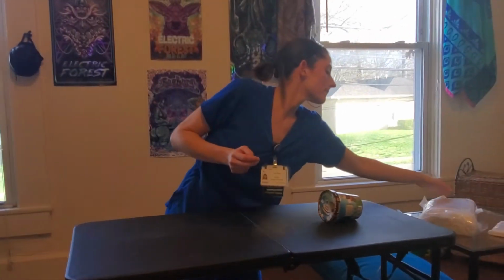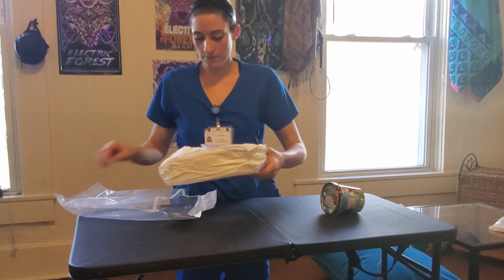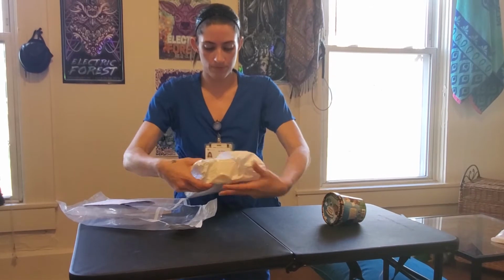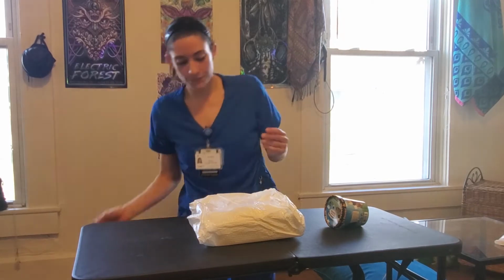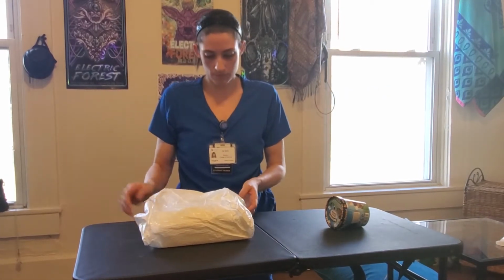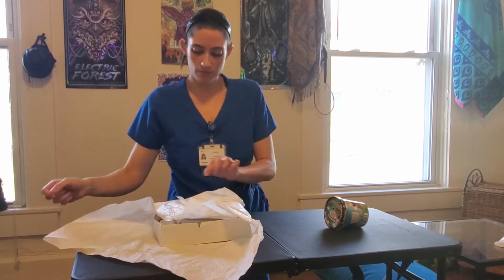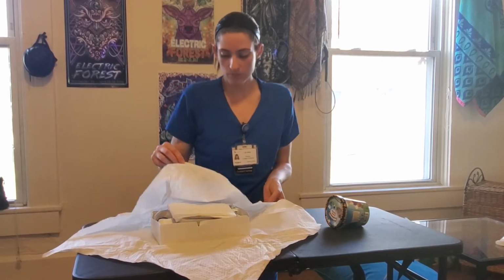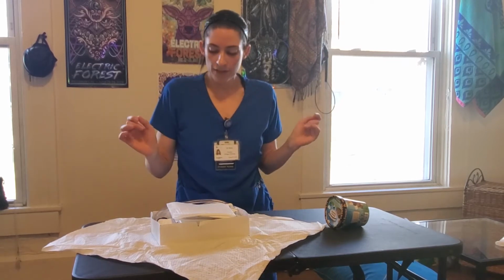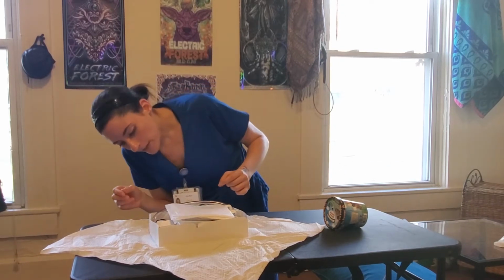So now we're going to prepare the Foley catheter tray. Place it on the bed between the patient's legs. So now I'm going to take the sterile drape. We're going to look for a good corner to pick it up from.